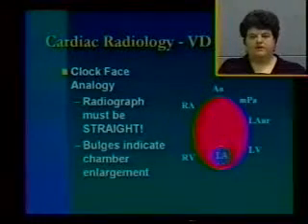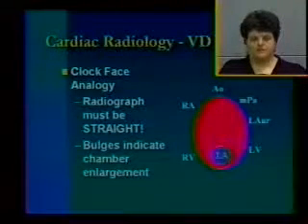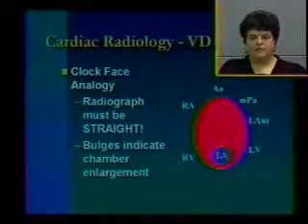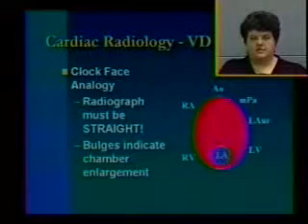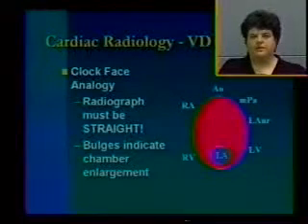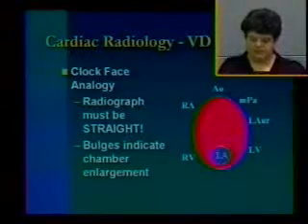So typically you have a nice V-shaped appearance to the main stem bronchi. If they become more U-shaped or cowboy, like a big bow-legged cowboy, then you need to worry that this dog has left atrial enlargement. And then rounding of the right cardiac silhouette is going to be consistent with enlargement of the right atrium and right ventricle, which typically all go together.